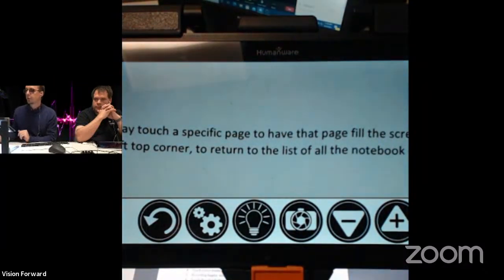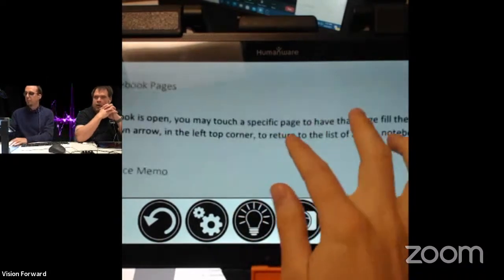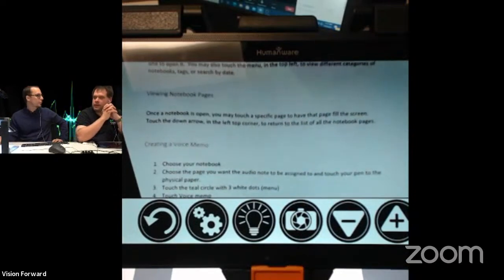Somebody else says that the Juno from APH has got OCR, and that's a 7-inch. That's what I was trying to think of, was the new Juno. Yes, thank you for that. That was Janelle. Thank you very much.